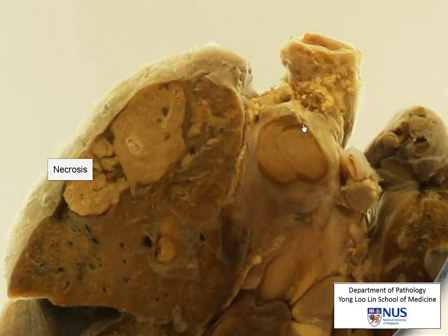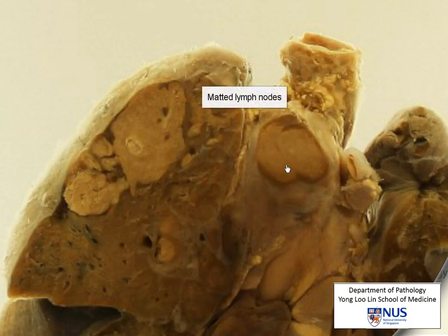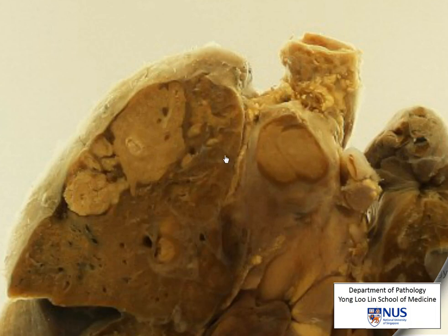Looking at the enlarged lymph nodes here, we can just about make out that there are actually two lymph nodes, but they seem to be stuck together. We call this appearance matted lymph nodes, and this is very classical of TB. When we see this abnormality — this pale area — it looks exactly the same as what's going on in the lung, so basically the same process is affecting the lung parenchyma as well as the lymph nodes.